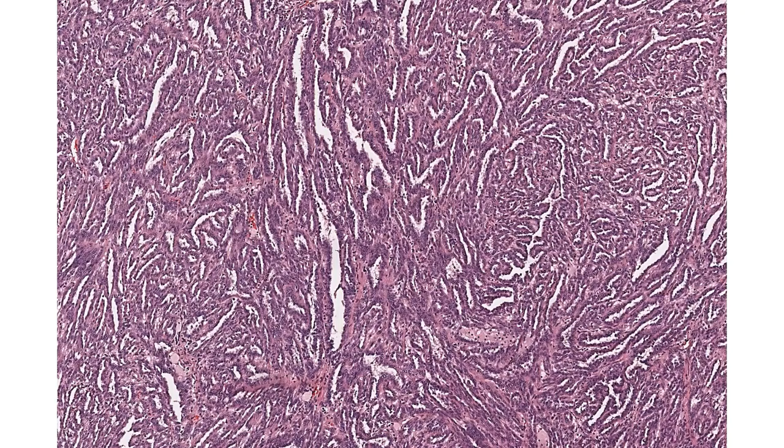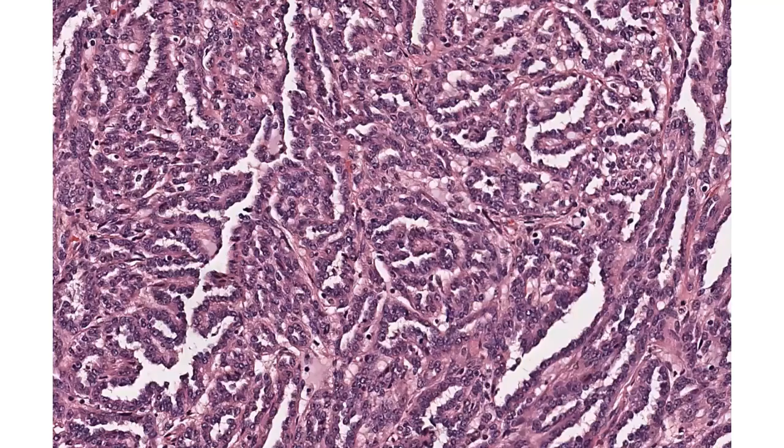this tubular to tubulopapillary configuration. So, on a true-cut biopsy, a tubulopapillary architecture such as this, with a poor component of mucin as well as an indistinct spindle cell element, could raise the differential diagnosis of a papillary RCC as well. So here you see the small tubules and the tubulopapillary architecture of the mucin-poor mucinous tubular and spindle cell carcinoma.